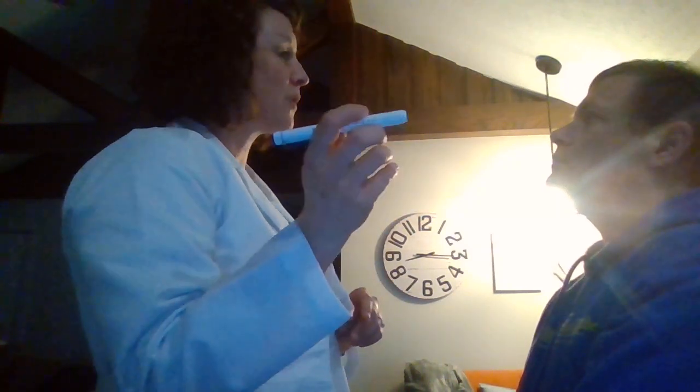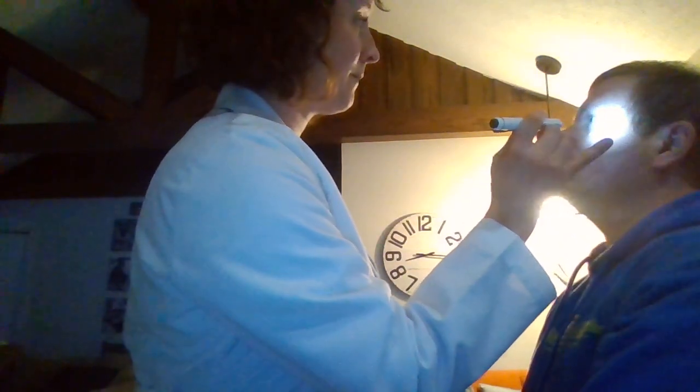Actually, first I'm going to shine this light into your cornea from an oblique angle. I want to make sure there's no opacities or cloudiness. Your corneas are clear. It's clear, there's no cloudiness.